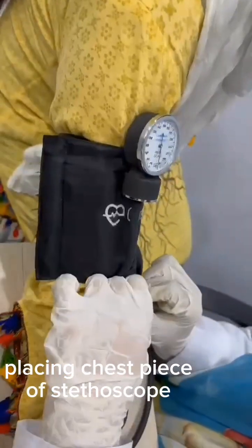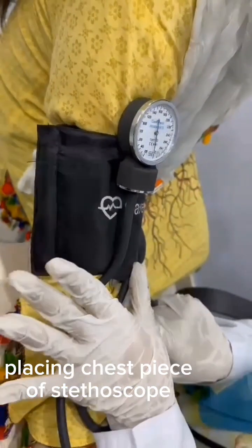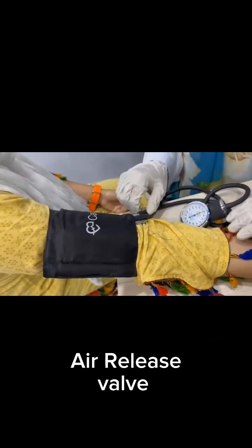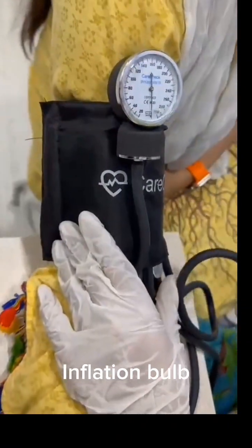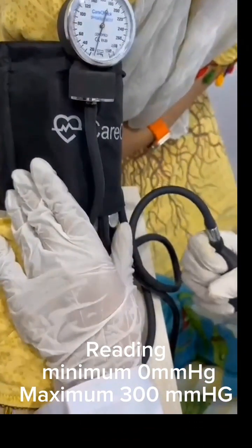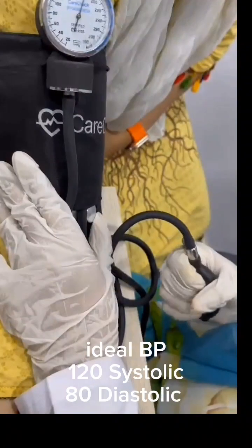Manometer for the reading. Place the chest piece of the stethoscope between the tube connectors. Air release valve. The diaphragm of the chest piece should be placed on the brachial pulse. Inflation bulb. Minimum reading is 0 and maximum reading is 300.